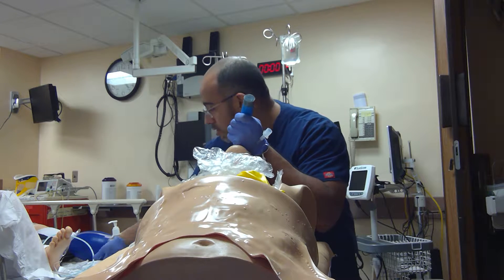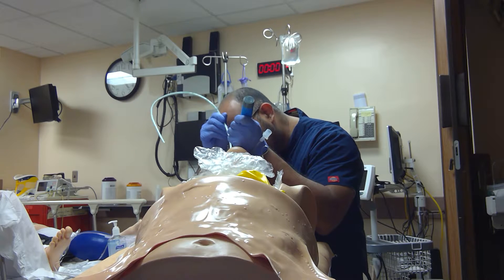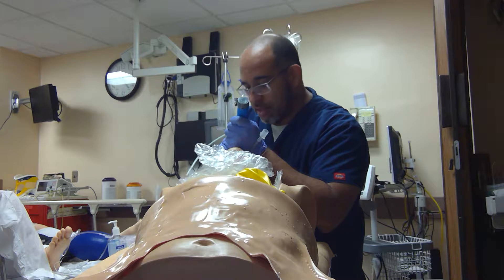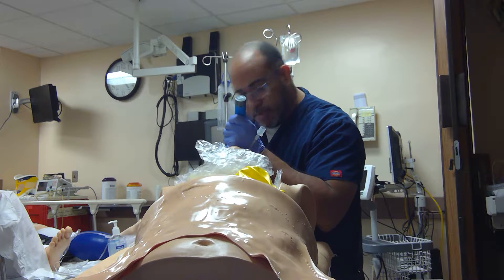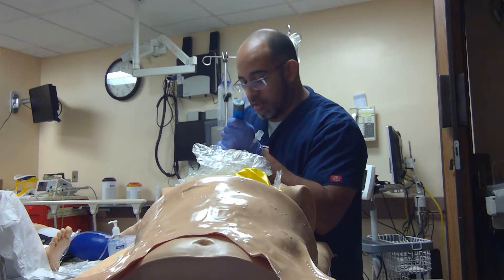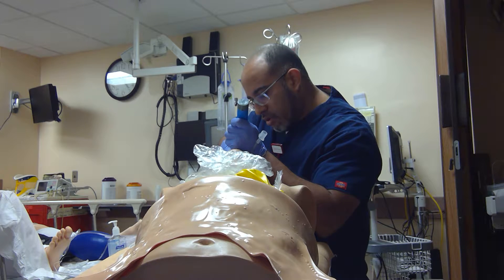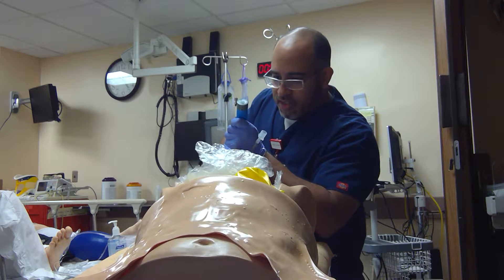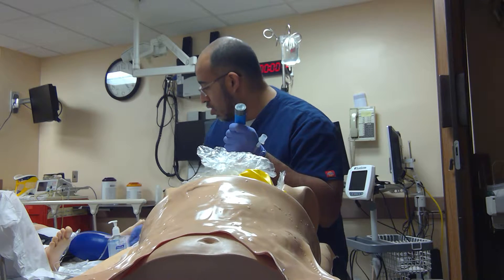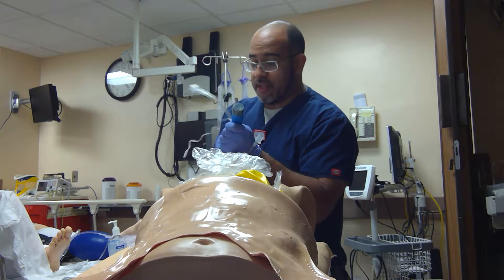Just a little bit to the left. I hope with this bougie I can actually squeeze it right next to it — snake down the middle. I hope. Quarter turn. Just did a quarter turn.